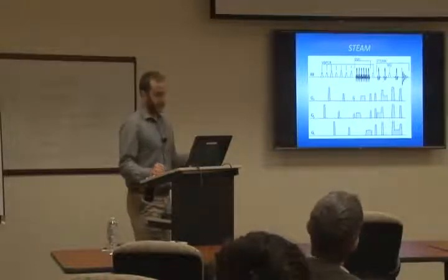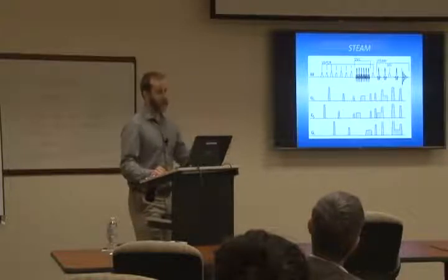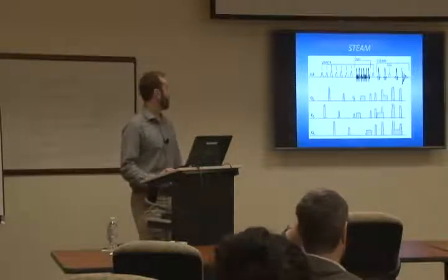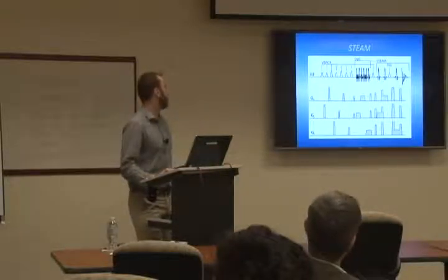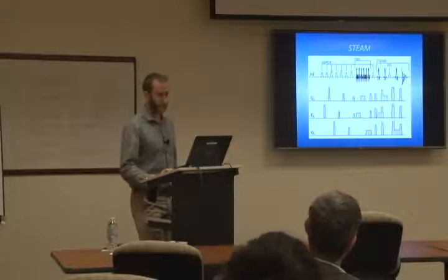So it's important to know that there's tons out there. And so this is a version of the STEAM sequence. On your system, every Siemens platform has a STEAM sequence, but this is one that we made a bunch of modifications to, and it's way better than what you get on the system.